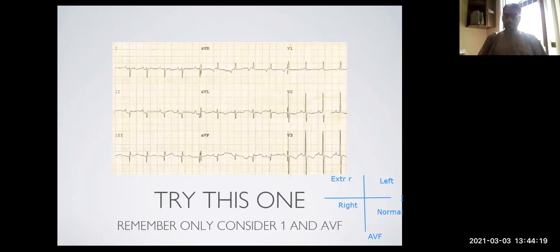That's a left axis deviation that we had seen. So let's try this one. So we've got lead one and lead AVF. Okay, so let's look at this one again. So let's start with lead one. So lead one is negative.